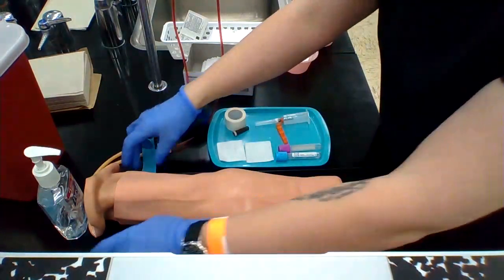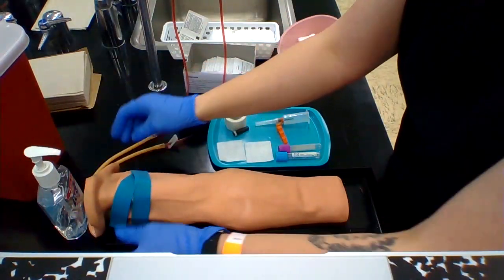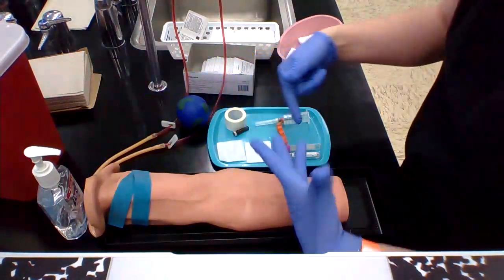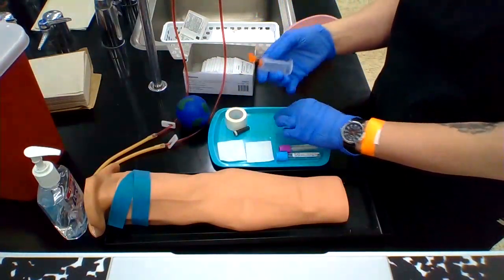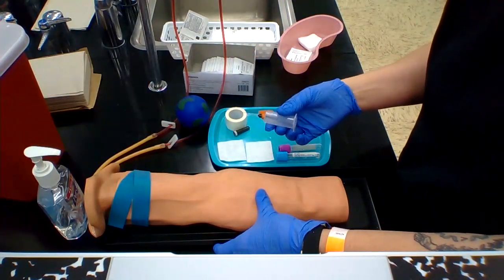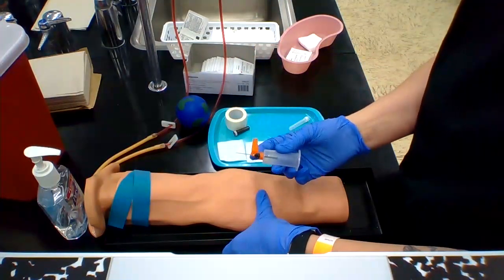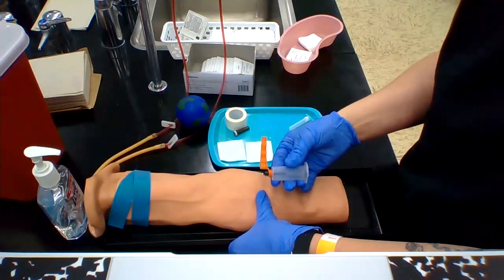Alright, my patient is dry. Apply that tourniquet again. I'm not going to actually tie it because this arm sometimes doesn't bleed when you tie it. Only uncap once you're ready to insert the needle. Sometimes you might have to rotate the safety of the device so it's not hitting the arm.